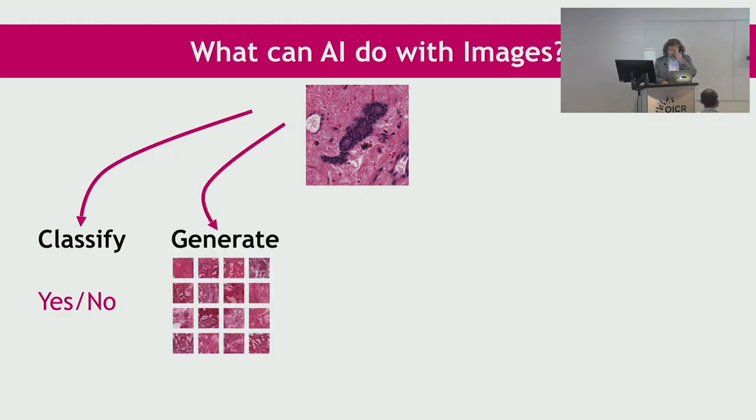Of course, we can also use AI techniques to generate images, basically fake images. And as disturbing as that is in the personal domain, where you can, I don't know, make old paintings laugh and talk and so on, in medical imaging it could be a blessing. We can create synthetic images. That's a new way of creating phantom images.